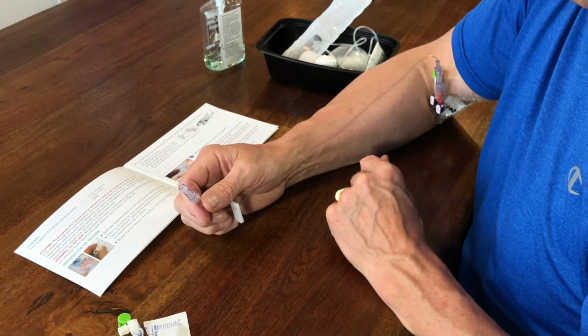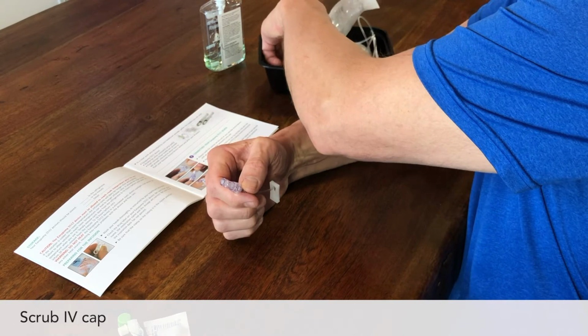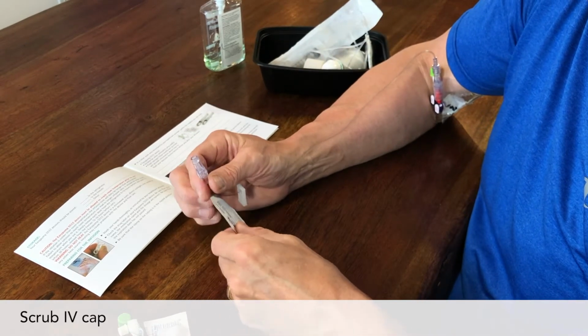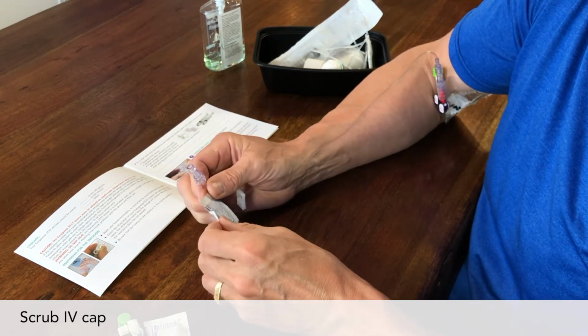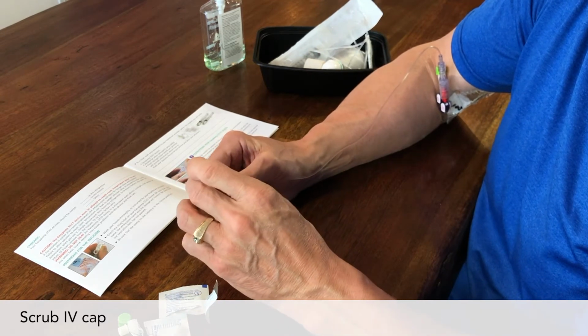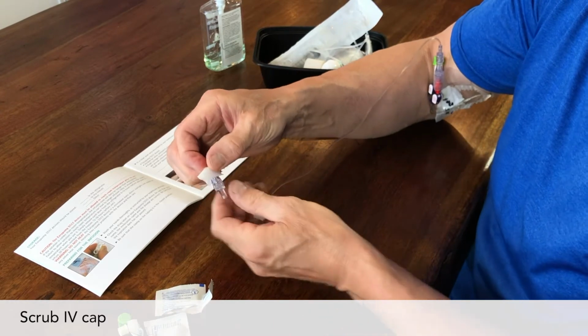You've just flushed your IV or PICC to make sure it's working well. You now need to clean the cap on the end of your IV. Open another swab wrapper and take the swab out. Scrub the top of your IV cap and the sides for 15 to 30 seconds. Scrub, scrub, scrub.